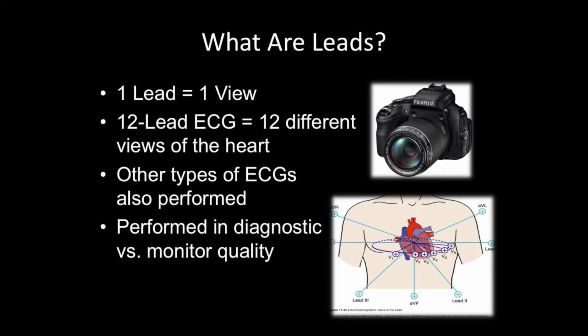And if you look at the slides here, I would be taking a picture from the front of the heart, and then I start working my way around to the left side. Why do I go to the left and not the right? Can I go to the right? Yes. Yeah, okay, so there's right-sided EKGs. Can I go to the back? Yes? Okay, so could I go to the left back? Or right back?